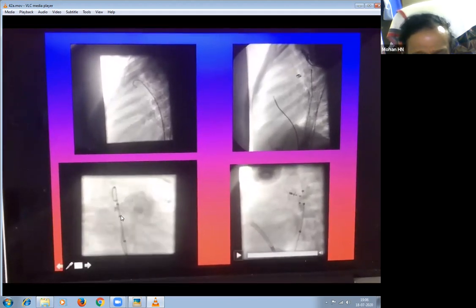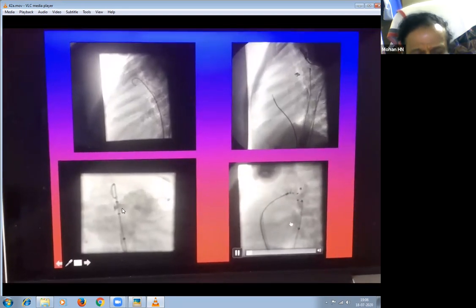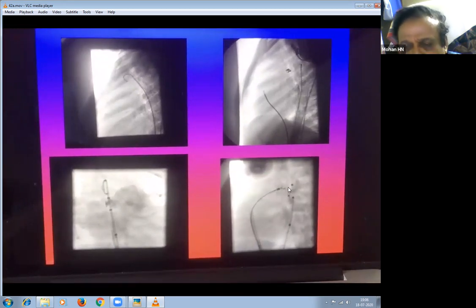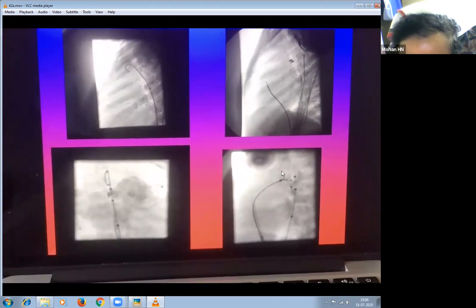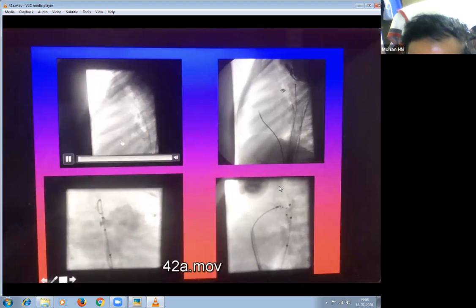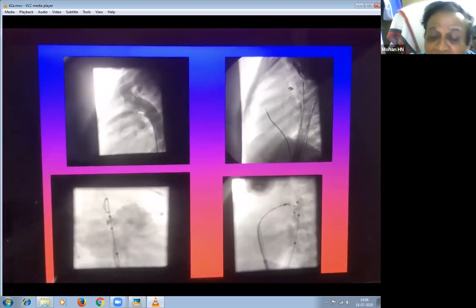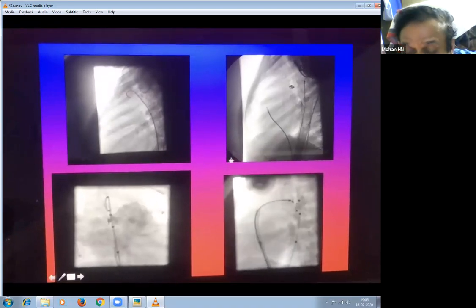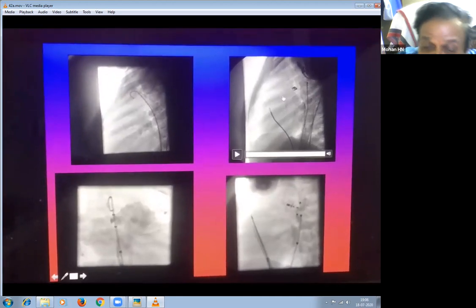You can see the angio here. This is a very large PDA. If you use more than 10 mm, it will occlude the aorta. Then this is the angle device, where the upper part of the device has been cut. It is specially made for this. Nowadays we have not seen it, but when Vijayalakshmi madam was there, we did around 10-15 cases with this one.